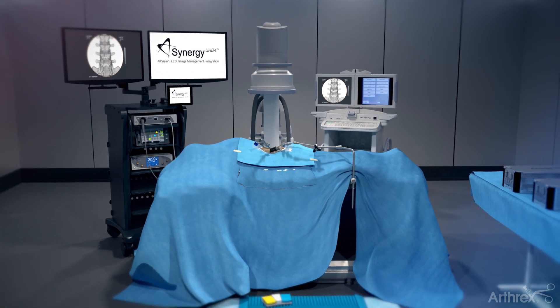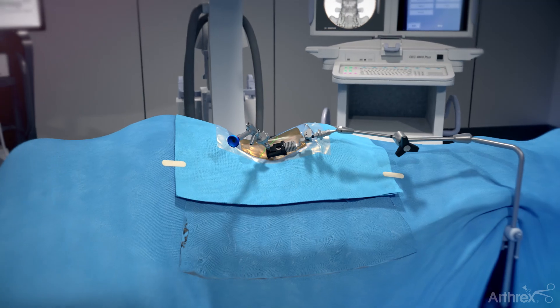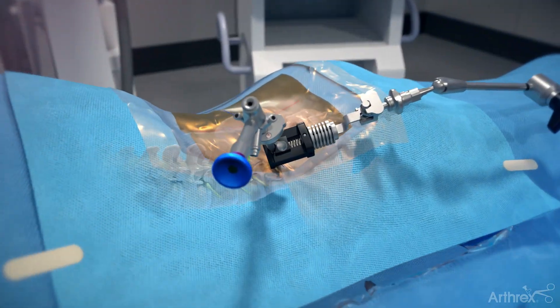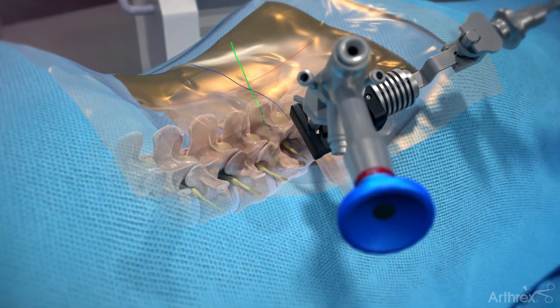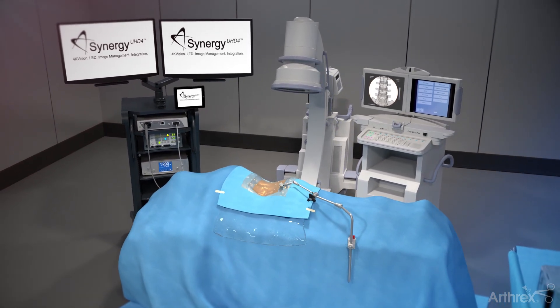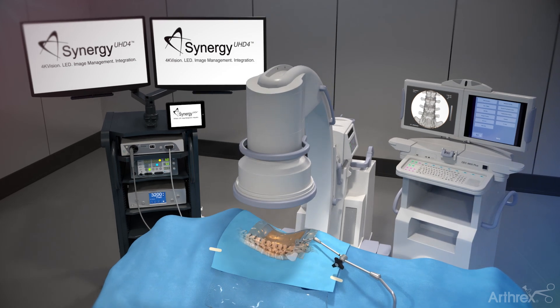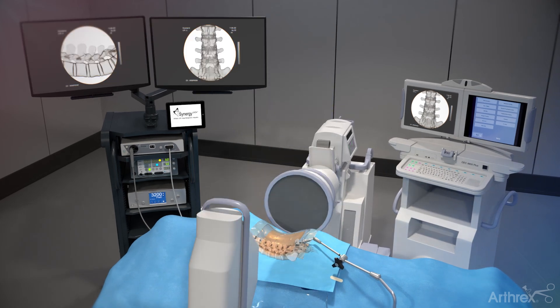Arthric's ultra-minimally invasive transforaminal endoscopic approach for an L5-S1 discectomy procedure utilizes an endoscope to assist for access and visualization. Place the patient in the prone position. Based on the preoperative MRI or CT, use the C-arm to verify the correct level using both AP and lateral images.